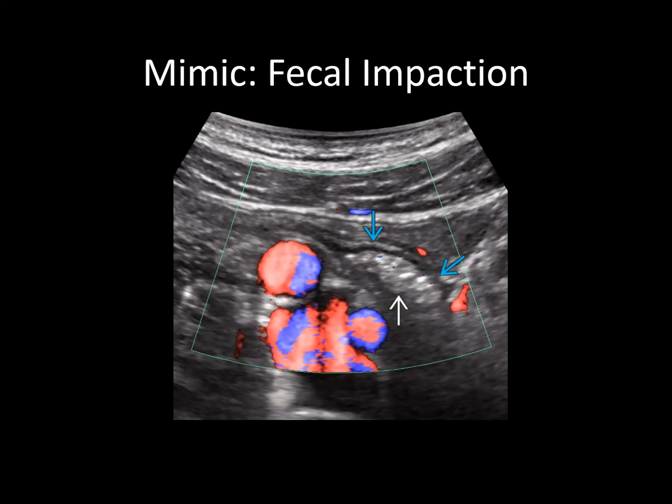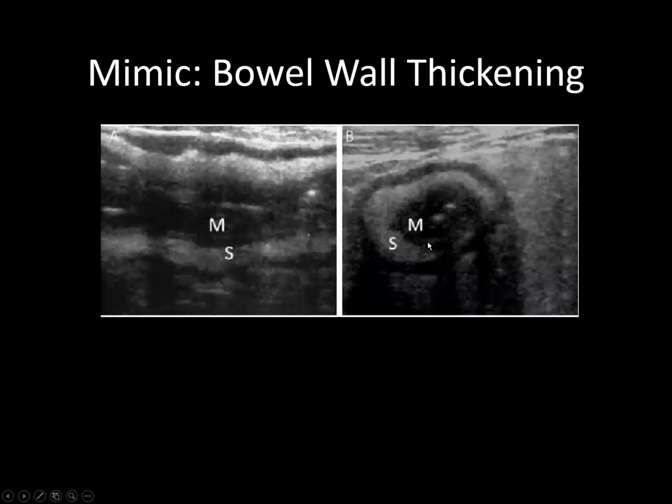So in this case, much like a dilated appendix with no other findings of appendicitis, same thing. Do not call it just on the basis of the distension in the presence of fecal impaction. When there's no other findings of appendicitis, just do not call it.